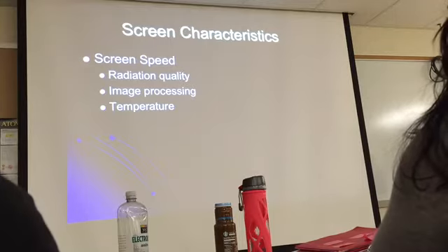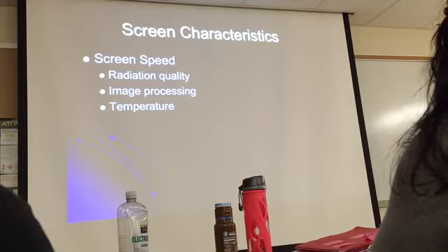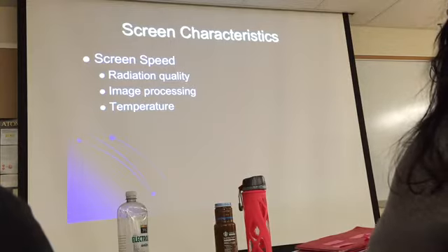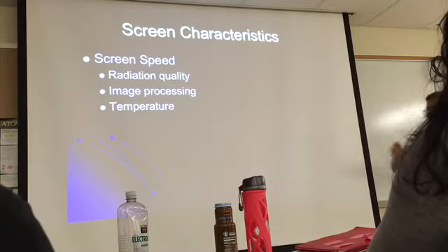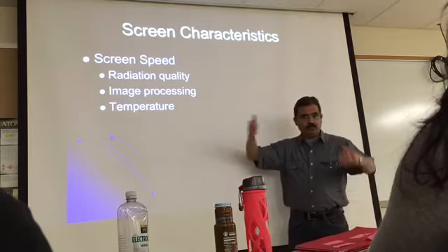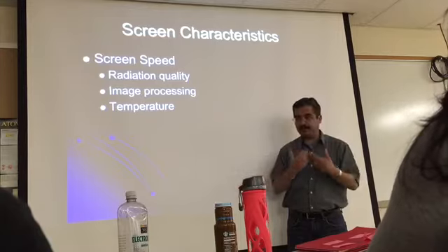For example, the great majority of our affiliates, with one exception, had the same film and they used it for regular work, abdomen, chest, whatever. And then they used another screen for extremities that would give you better detail. Do they use a different type of processing for that? No. Both systems were processed in the same processor.